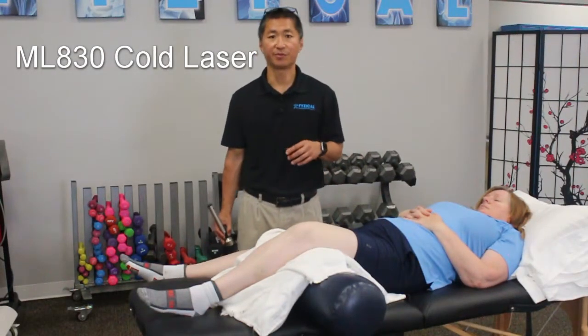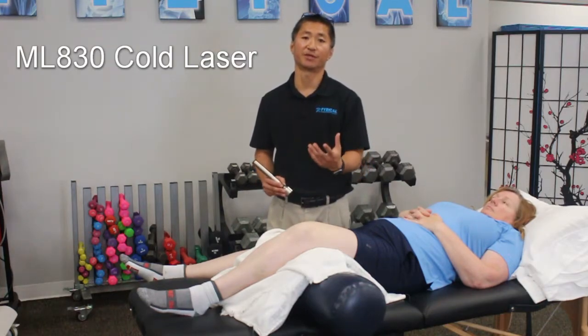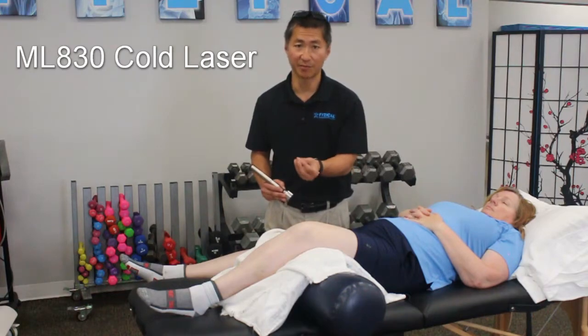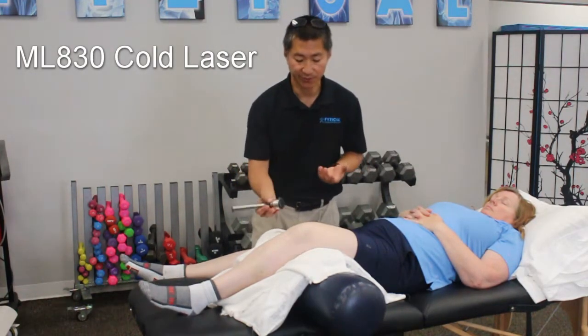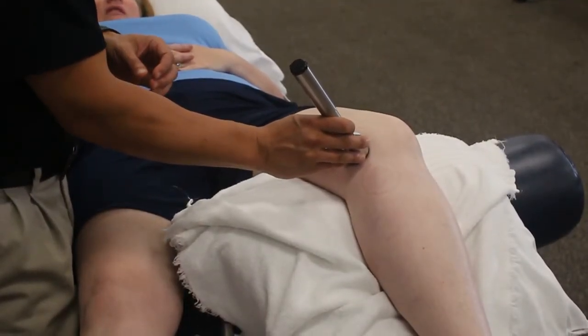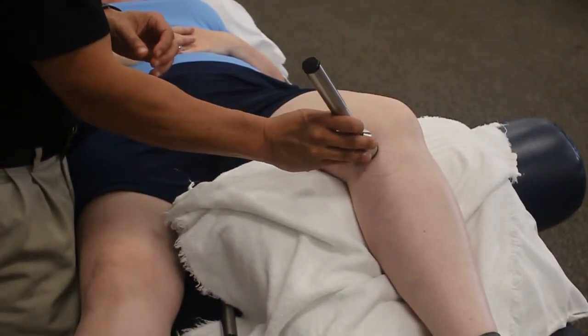Okay, so after we've used the Miracle Wave, what I want to do is just speed up the internal body processes to try and encourage the natural body reaction to get the chemicals down there to heal. And the way we do that is with cold laser. We have a class 3 laser here, and we're going to put it right over the MCL, right over the quad tendon, and treat that for around about 2 or 3 minutes on each section.